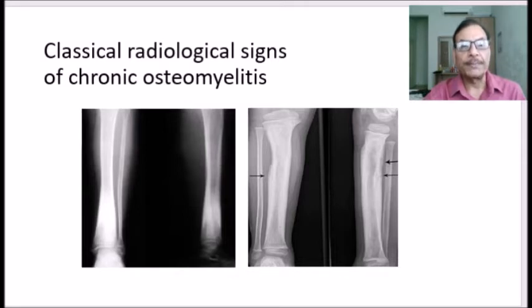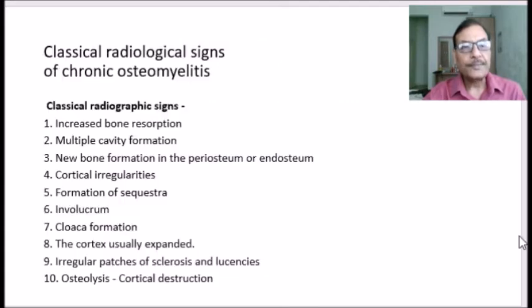And this is very important for all the medical students and doctors to know about chronic osteomyelitis management in hospital practices. So what are the classical radiological findings that we must look for when we are given an X-ray of a case of osteomyelitis?